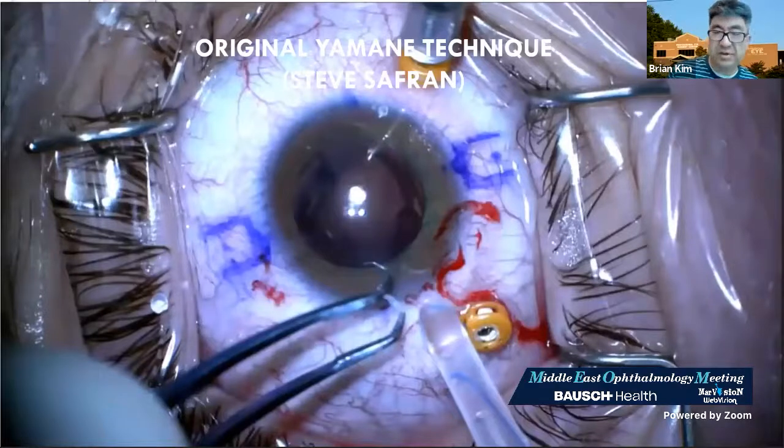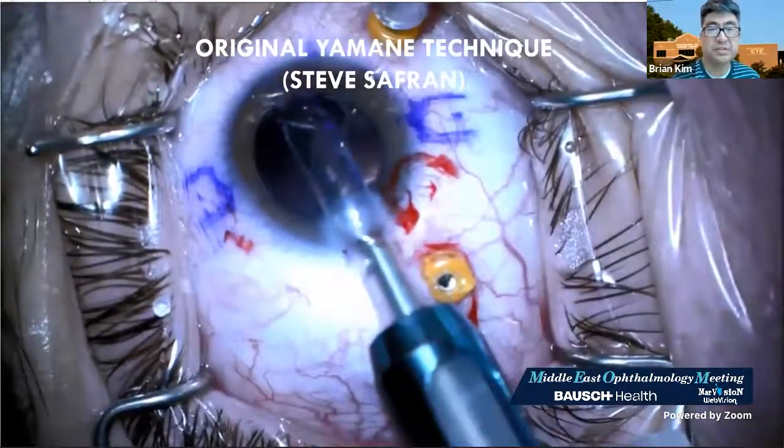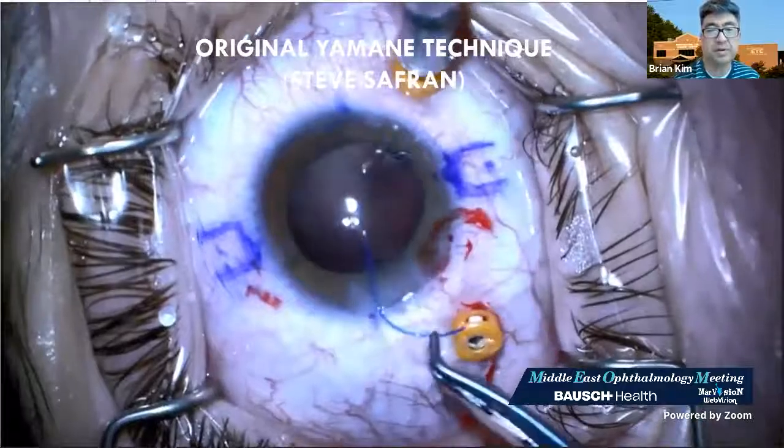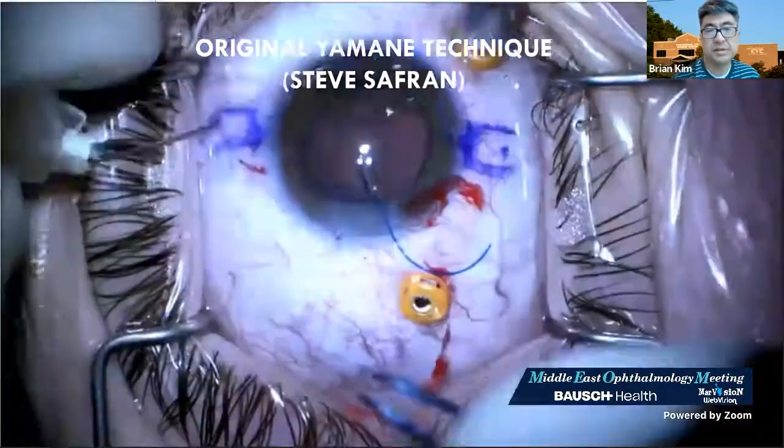My friend Steve Safran does it the classical way. And so let me just show, and he uses Dr. Ashvin's marker for his technique. So let me go ahead and show this. So the lens is injected and he places the leading haptic into the angle. He starts on the left side and he tunnels and goes in.